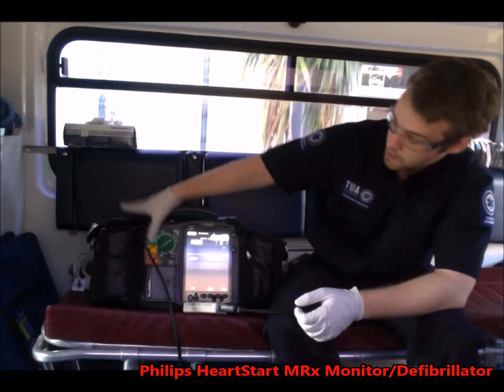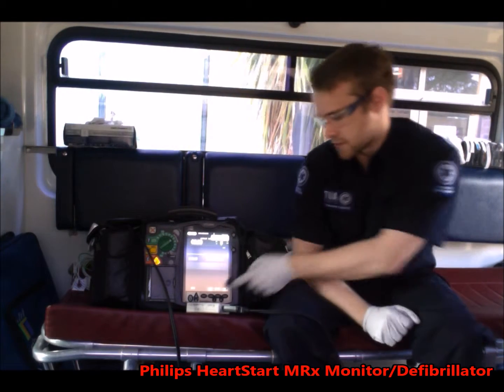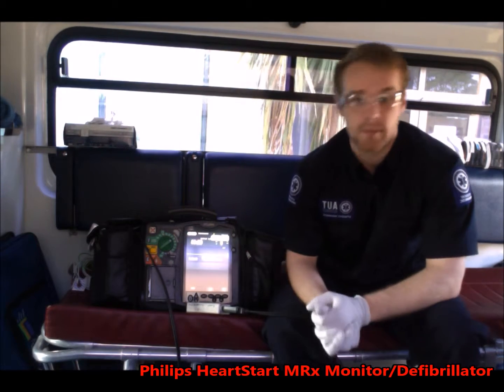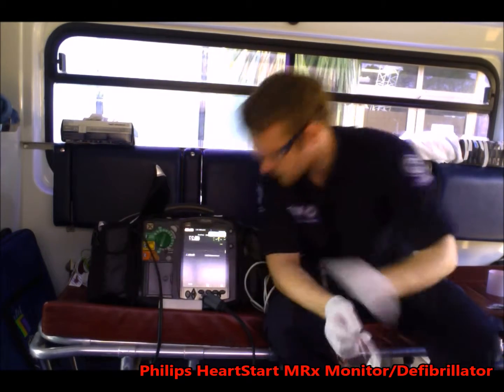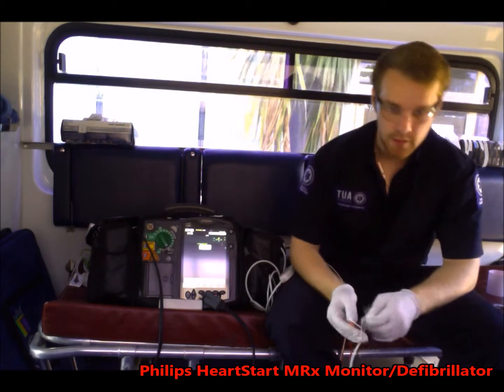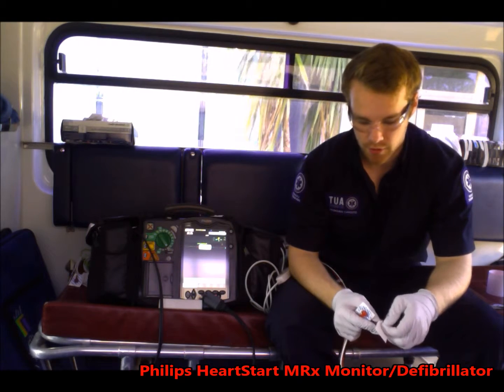If we wanted to disarm a charge, it's a similar process. We charge it up, and we just press the soft button down here that says disarm. And then the defib is disarmed. So if we're on manual mode, we can switch to AED mode by turning the dial to Apply AED pads to patient's bare chest. So that will turn it into AED mode, and that will analyze and suggest whether a shock is necessary.